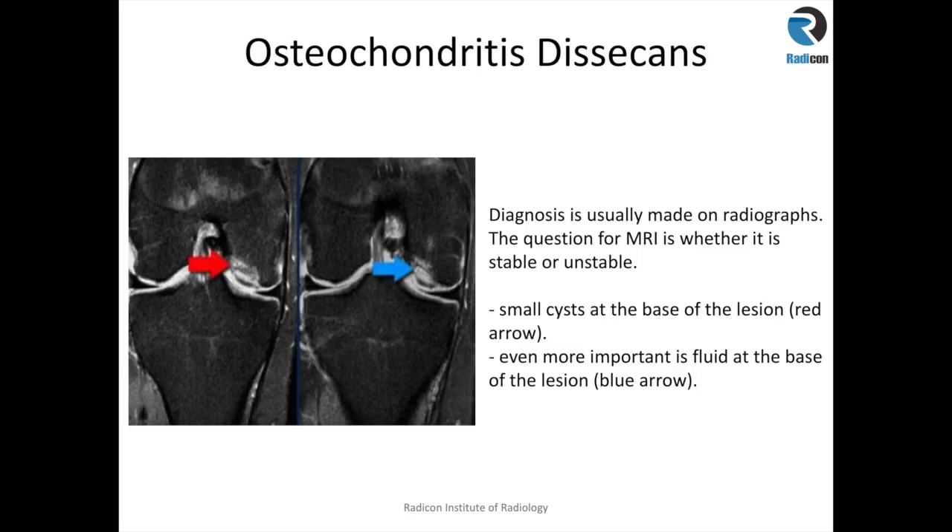Osteochondritis dissecans or osteochondral lesions can be diagnosed on radiographs, but the value of MRI is to assess the size of the lesion, determine if it is stable or unstable, and to identify detachment of the osteochondral fragment and its location. Signs of an unstable osteochondral lesion include cystic changes in the underlying bone, as shown by the red arrow in this image, or a linear fluid signal intensity at the base of the lesion between the underlying bone and the osteochondral fragment — a reliable MRI sign of instability.